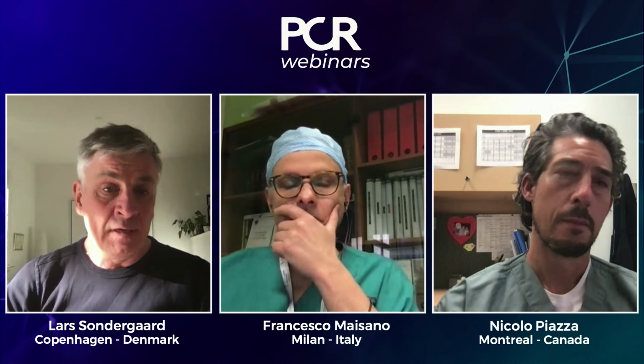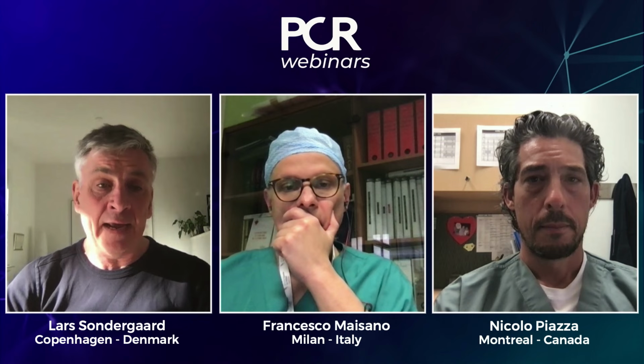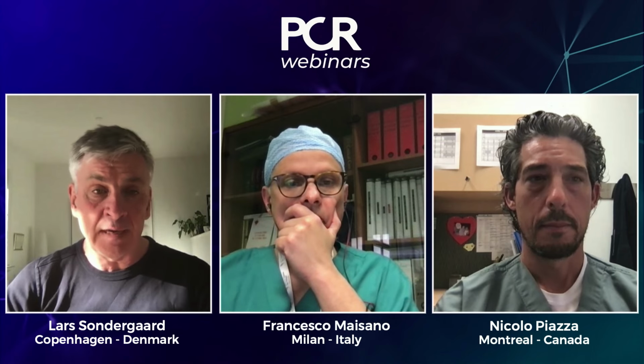You can see here, as time is moving to patients with longer life expectancy, there will be issues which we did not consider in the past, where we were treating patients with a few years of life expectancy, and it was all about improving symptoms and quality of life. But now, as I said before, it's a much more complex decision. Durability is certainly one thing to take into account. Access to the coronary arteries, conduction abnormality, need for a permanent pacemaker, and what about paravalvular leak? And I also think that we cannot make one decision for all patients. We have to look at each individual patient and see what is particularly the issue for this patient.